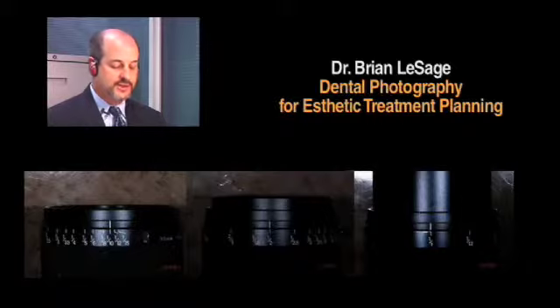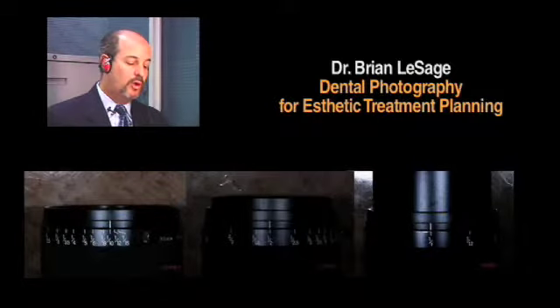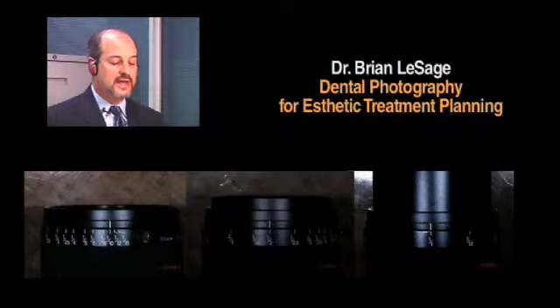And so if I'm suggesting you take certain images at 1:1 on your digital, which most of you are probably going to venture into if you're not there already, you'll put it to 1:1.5. So spin your lens to 1:1.5 for this image, and then a 1:2 is a 1:3. Okay, so I want to make sure that's really clear. 1:10, unfortunately, when you get up into 10s and 12s and 15s, you'd want to set it to 1:15. There usually isn't a 1:15 in there. So really what you want to do is look at what you want as composition in the photograph, and I'll show what you want in a 1:10 view.